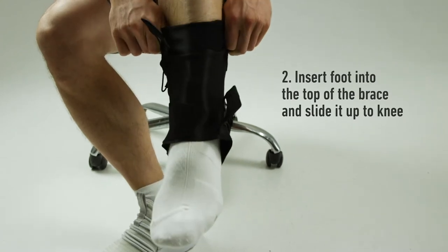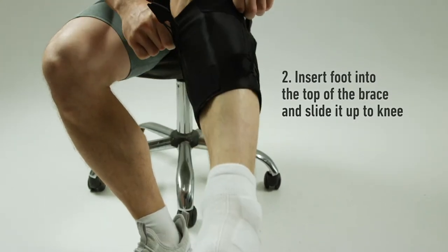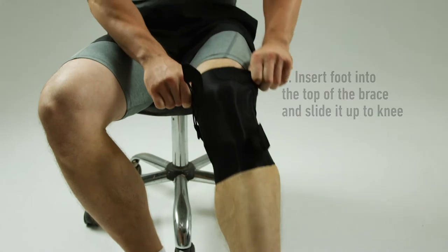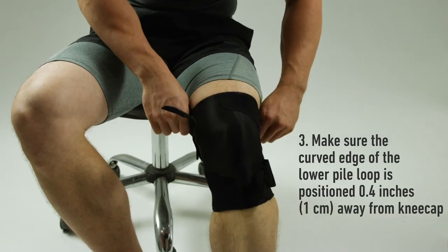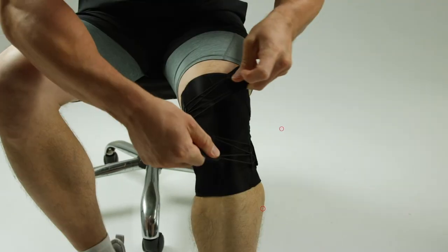Using both hands, hold the brace and insert your foot into the top of the brace and slide it up to your knee. Make sure the curved edge of the lower pile loop is positioned 0.4 inches or 1 centimeter away from your kneecap.